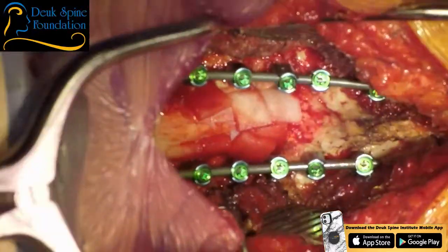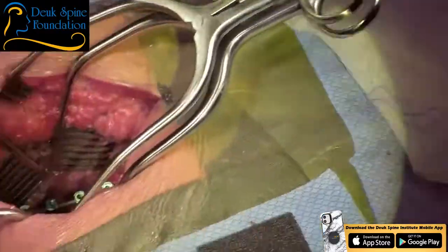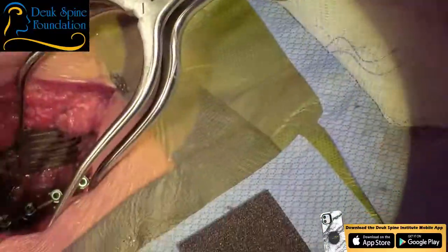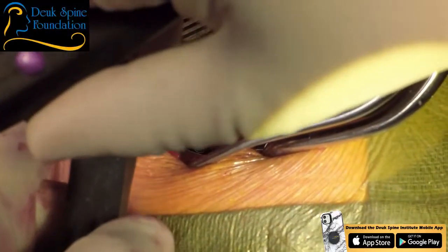Let's see what we got. Does that look cross-threaded? Doesn't look cross-threaded to me, Patel. What about you? Irrigation? Looks good? All right, counter torque wrench, final tightener. Let's get rid of the bender. So we're going to tighten everything up with a tension-limiting driver.